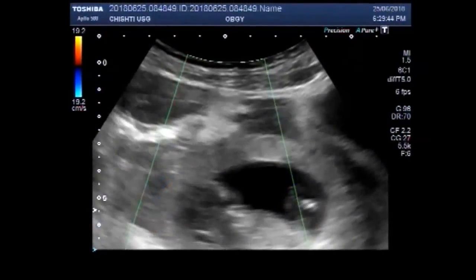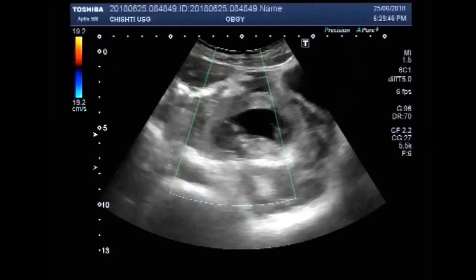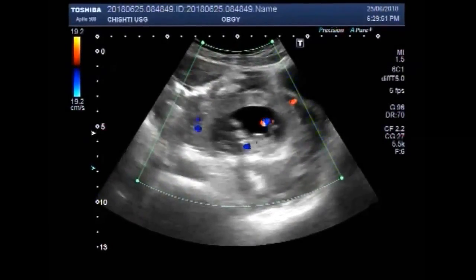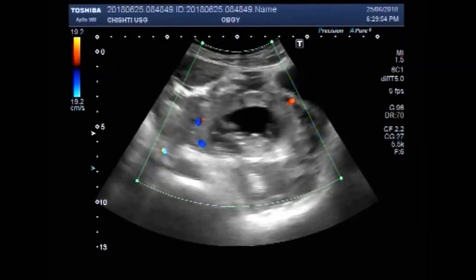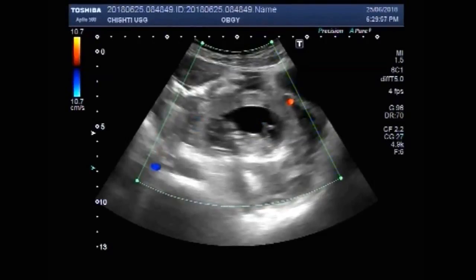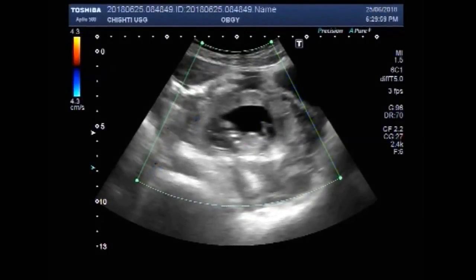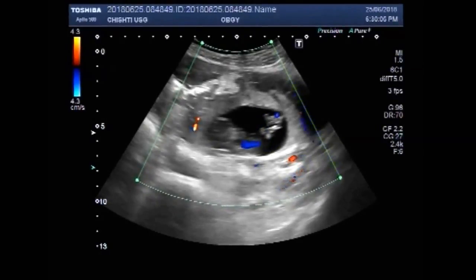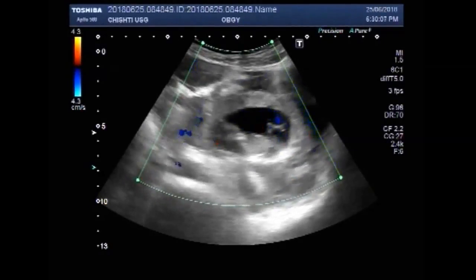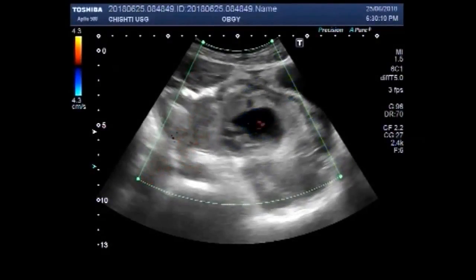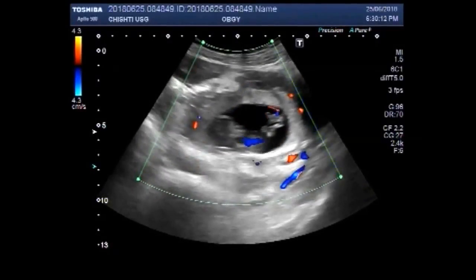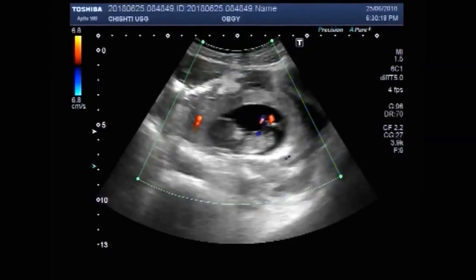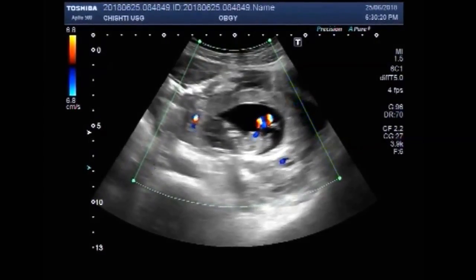You can see the blood flow. Blood flow is also seen inside the fetus. You can see the blood flow.